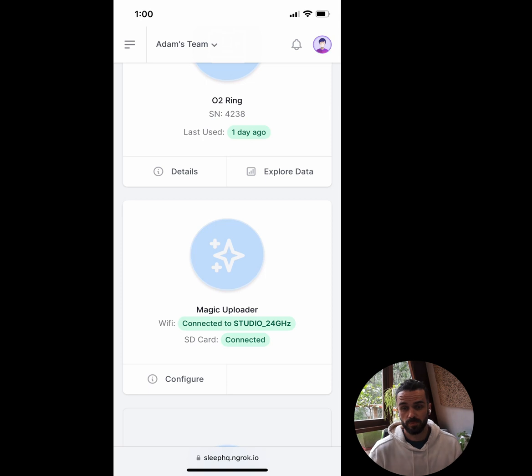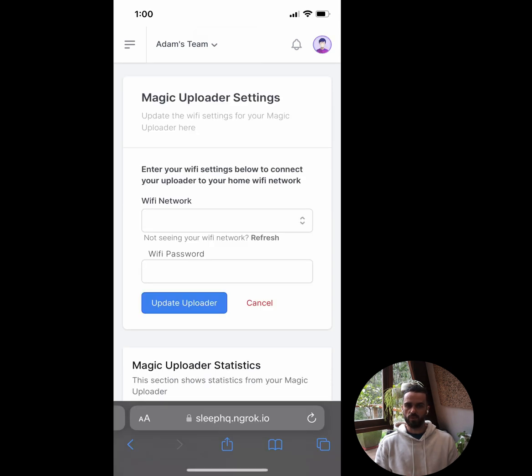That's basically it — my Magic Uploader is connected to my home WiFi and to my CPAP machine. The next time I use my CPAP machine, it's going to take the files off it and automatically send them up to my SleepHQ account. If you ever change your home WiFi password, you can hit the configure button on the Magic Uploader and enter a new WiFi network and password. Same thing if you're traveling with your Magic Uploader. If it's not able to connect to your home network, it will automatically start broadcasting its own network again so you can start the setup from scratch.